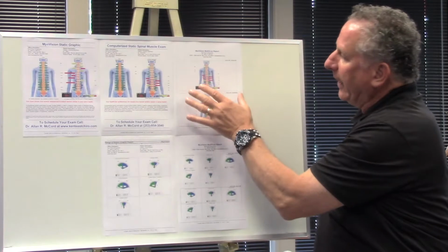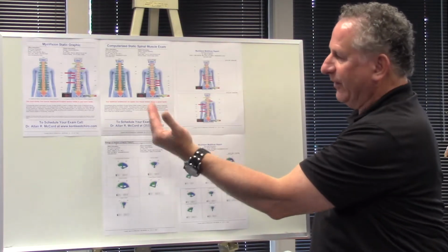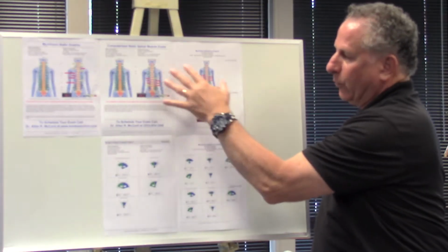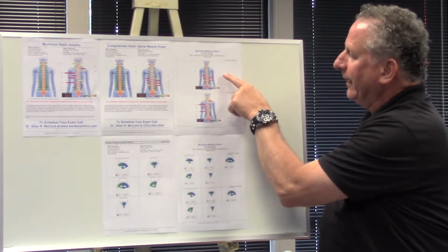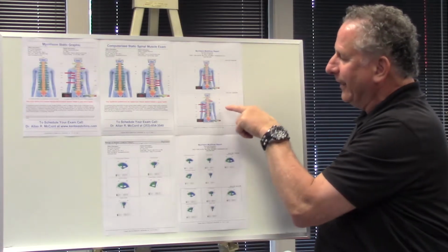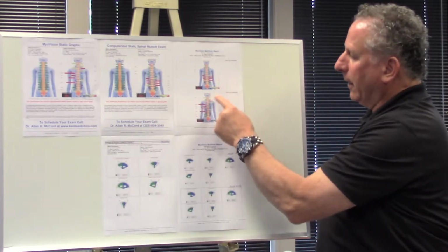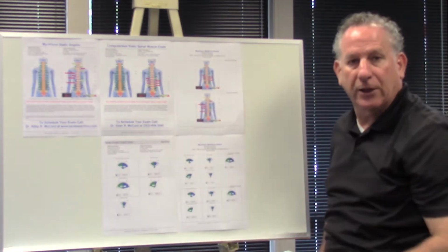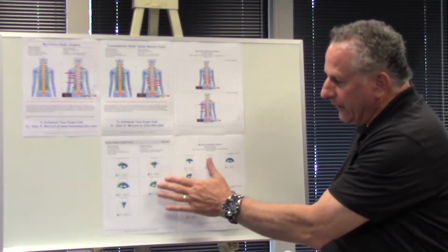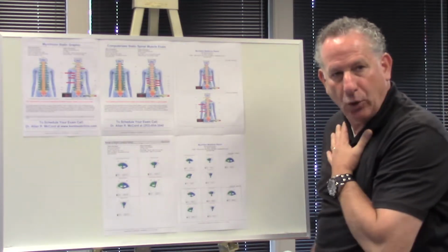And so here in the test, we do a follow-up about 10 to 14 visits on average, about 12 visits out. So you can definitely see a definitive difference in what's happening with the patient's spine. This is a report that we would show to the patient on the following visit once we do the second test. So here was the original test that coincides with this page here, and then this is the follow-up test, so we can begin to show the differences that we're making when we make adjustments.